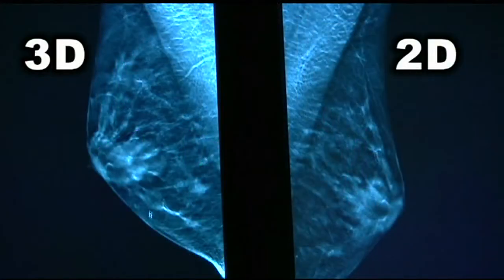Now, I've never had a mammography. I can only imagine that they're not the most fun. I've heard things about them being cold, about them being uncomfortable. What's the process for going in and getting a 3D breast exam? Well, we are doing three-dimensional mammography as well as two-dimensional mammography on every woman that comes in. The patients themselves aren't really going to see a great difference in the actual positioning. Both of those images are acquired during the same compression, so they still only get the four positions.